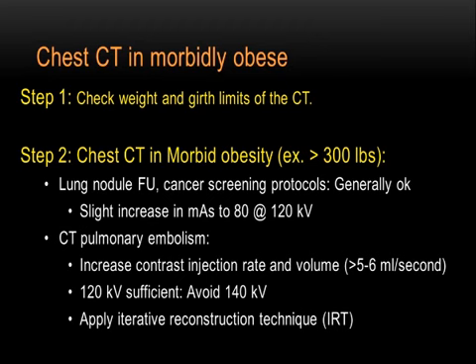But for chest CT, again, you need to check both the weight as well as the aperture. You need to measure the patient's circumference as well as the patient's weight, and check what your scanner would allow you. And as we learned yesterday, lungs are not that much affected by either patient size or dose. If you're looking for lung nodules, doing a lung cancer screening protocol, or primarily just lung, generally you do not need to do much. I would still maintain a kV of 120. I would not go to 100 or 80 kV, but 120 should generally be sufficient.